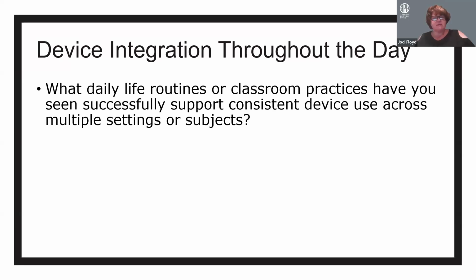For magnifier uses, the same idea. So one of my other students used a magnifier in class, in ELA specifically, to try to speed up their reading. Well, we brought in other things for them to do with that magnifier. We brought in a takeout menu from their local restaurant that they liked. We also brought in grocery store flyers and an Oriental Trading magazine or catalog. And we're like, let's look, help me plan my grocery shopping for this weekend, because students love to help you out to do things like that.